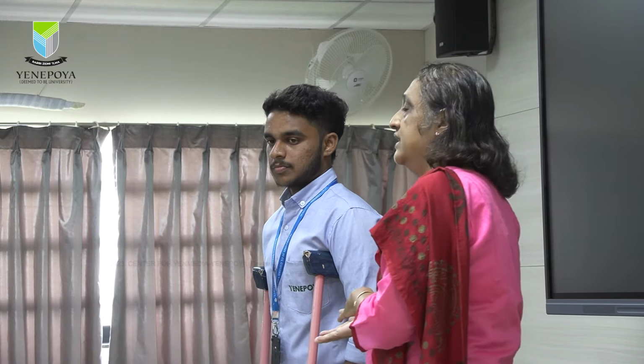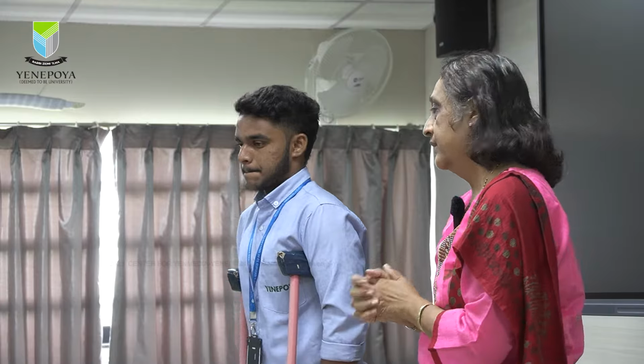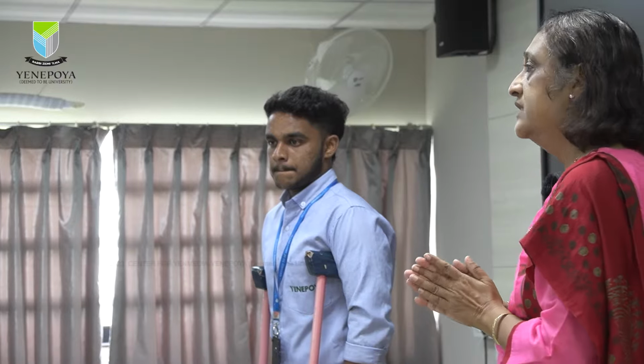And we have to see how comfortable the patient is, or how well he adapts to the walking pattern and to the crutches.